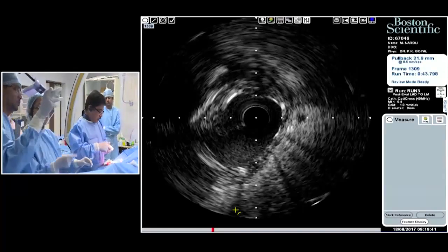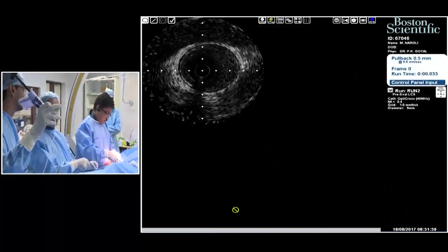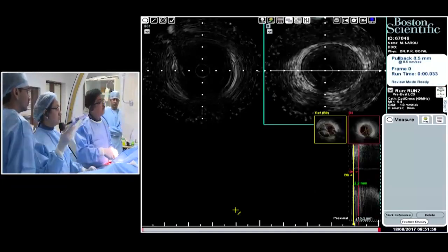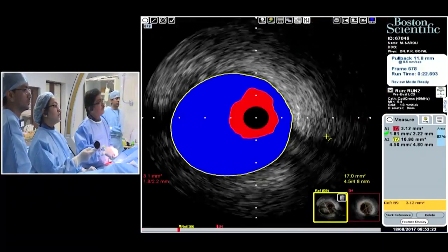Now you leave the ostium, show the left main? You're always worried whether it will dissect at the junction. That is one of the major points. Actually, if you are not covering, you may land up in a problem of the LMCA. No, I have partly covered the ostium. I'm not worried about that. You have to take a balloon, and a high pressure dilatation is required.